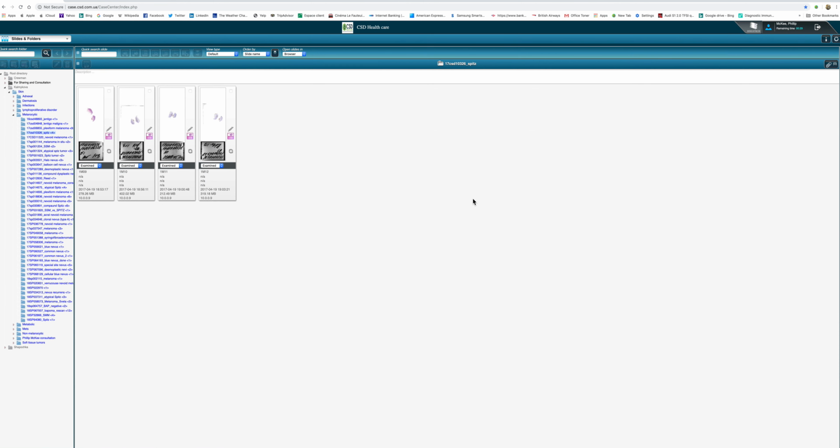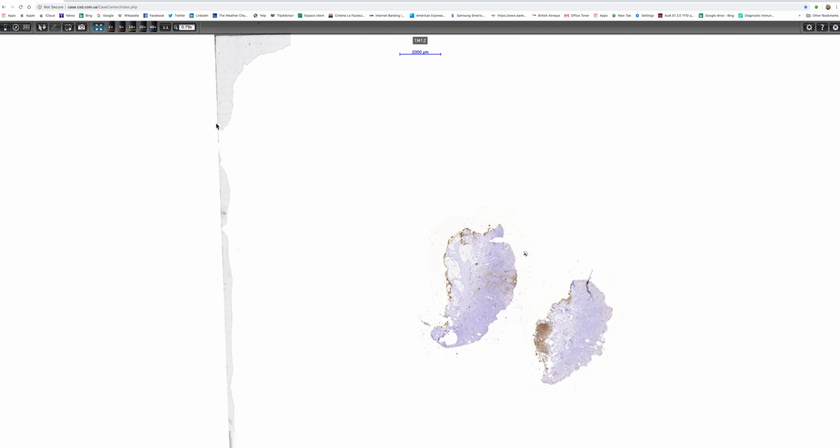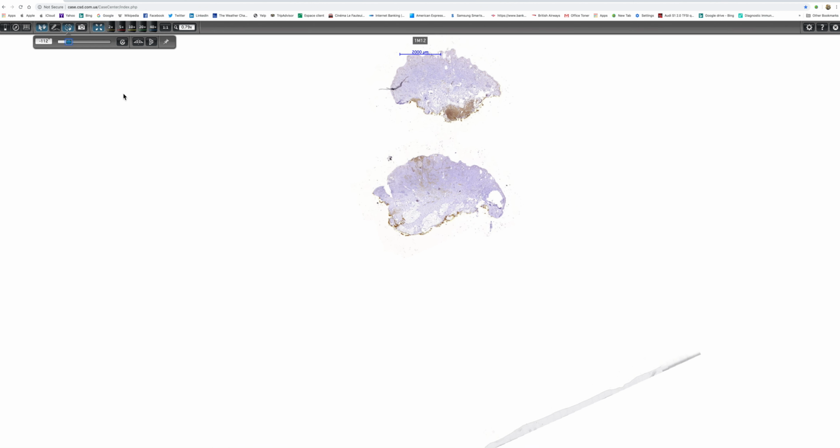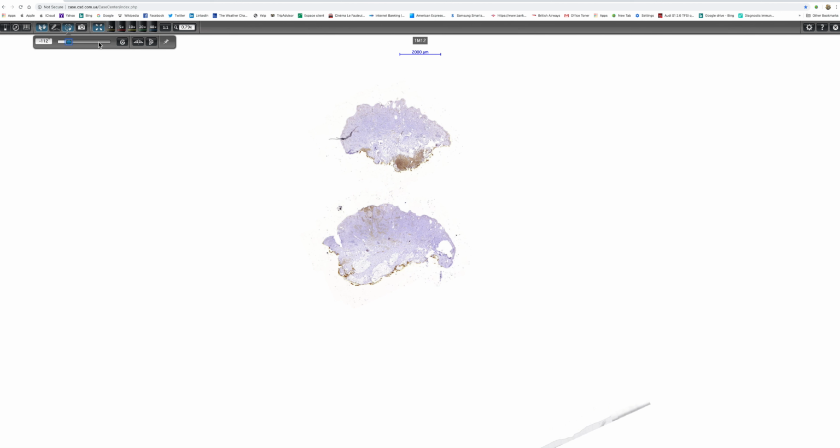Now, what else? I've got two other immunos. Gosh, I've forgotten what they are. I think this one is, let me just see. We'll just have to turn it around and look at it in close up to see what it is.